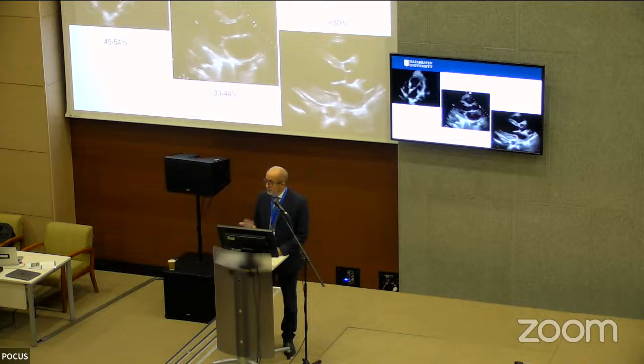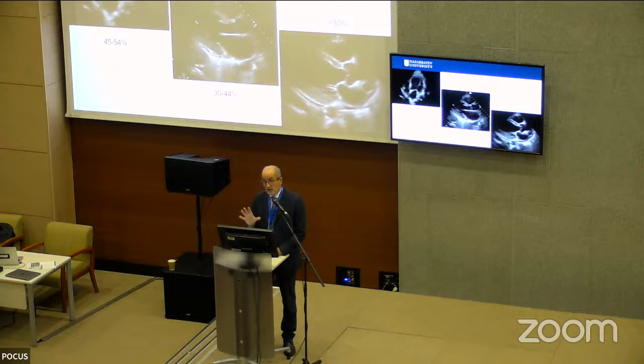Of course, this is a visual assessment, so eyes can be different from person to person, from cardiologist to cardiologist. So maybe the agreement is not ideal, but still, despite all this limitation, the assessment of the left ventricular ejection fraction by eye is extremely helpful, solid, with a lot of information in terms of prognosis.